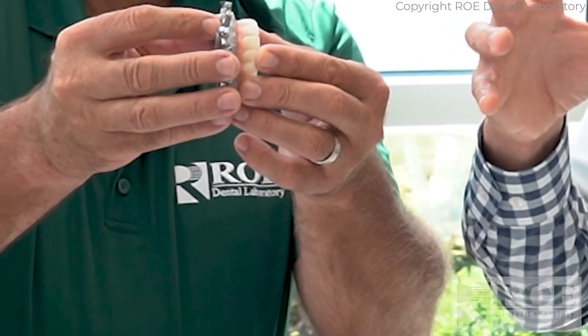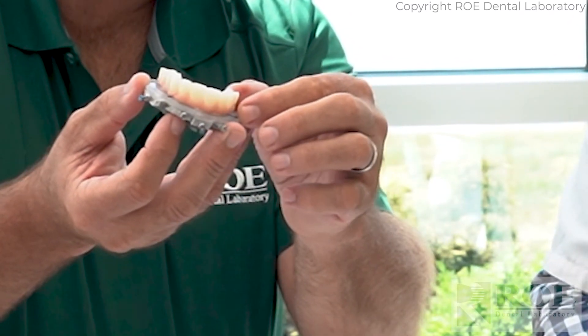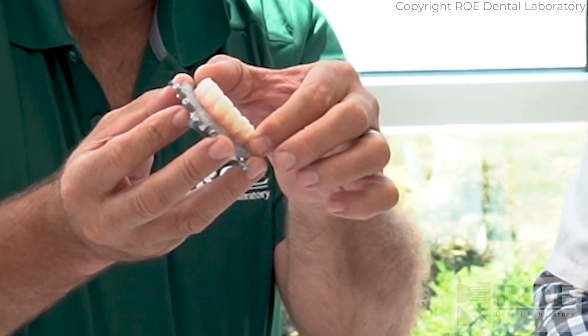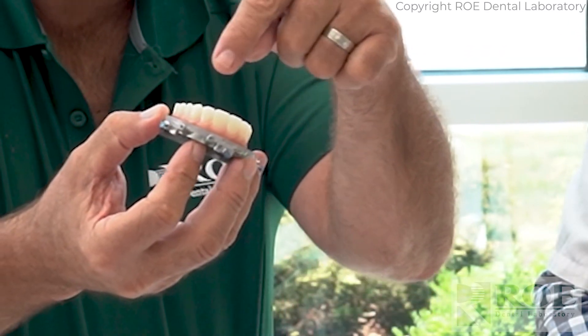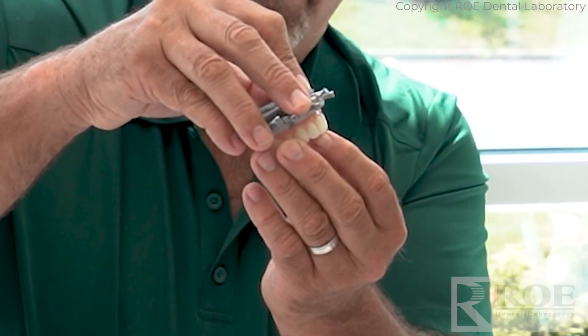Occasionally we have a little bite discrepancy, and you can test that really early in surgery. Once you have your bone reduction done and your carrier guide is in, put the prosthetic in and close the patient before they have too much fatigue — and if you've got a bite situation, take some articulating paper, mark it, and reduce outside the mouth. You can also shimmy it: you can wedge the anterior, wedge the posterior, and float the prosthetic until the bite is right. Flow the bonding material around the cylinders, don't cure it, have the patient close into the bite, shimmy it, and then cure it — you'll have a perfect bite.